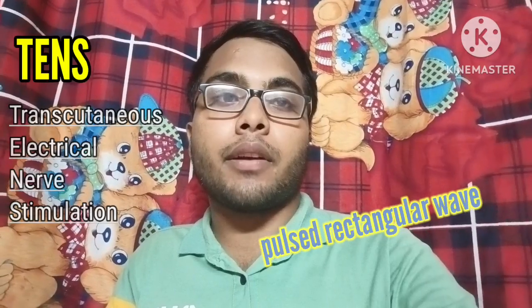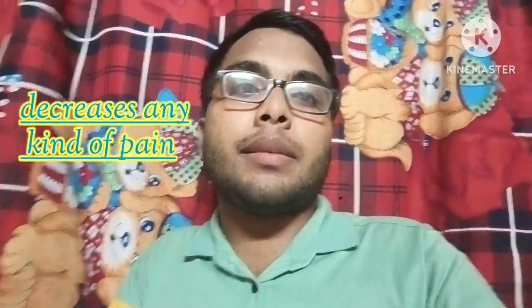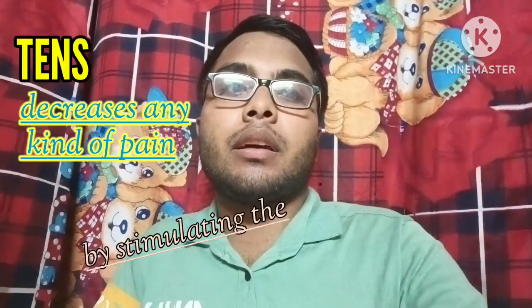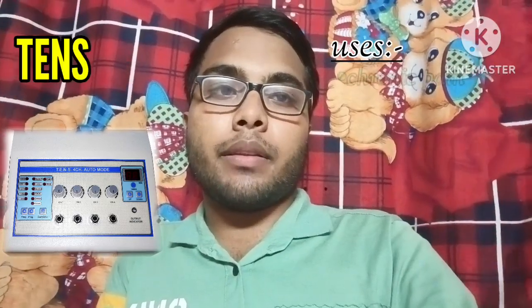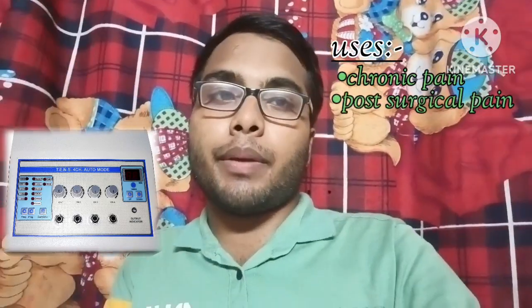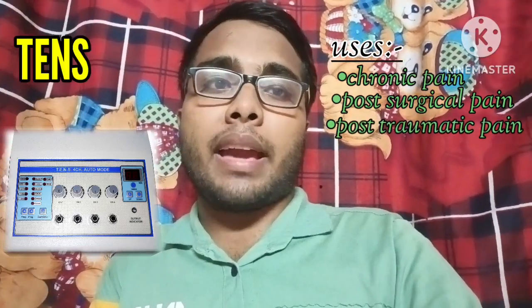The next type of current is TENS. TENS means transcutaneous electrical nerve stimulation. It is a pulsed rectangular wave current which commonly uses a frequency of around 150 Hz. The main use of TENS is to decrease symptomatic pain by stimulating the pain gate mechanism or the opioid system. Common uses of TENS are in chronic pain, in the management of post-surgical pain, and in the treatment of post-traumatic pain or any kind of acute pain.